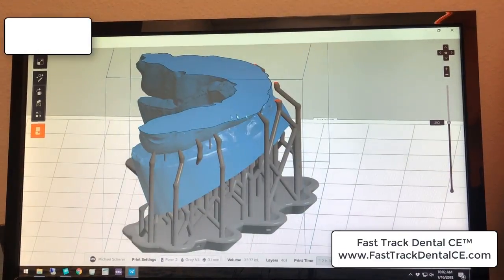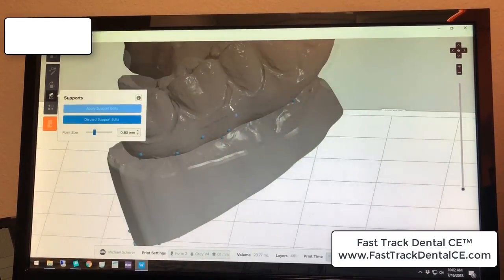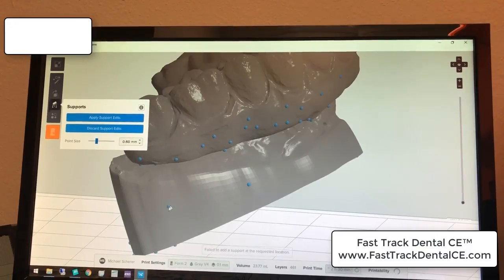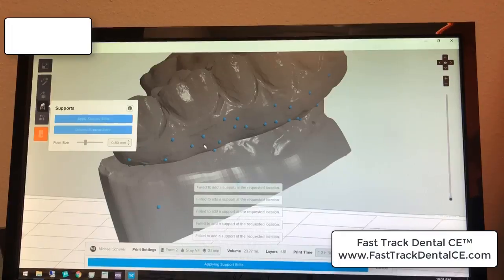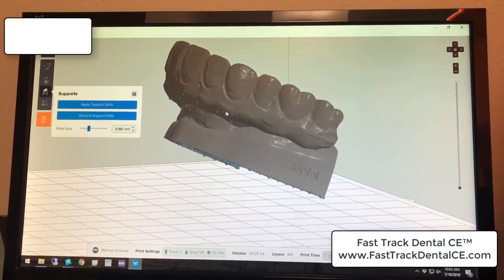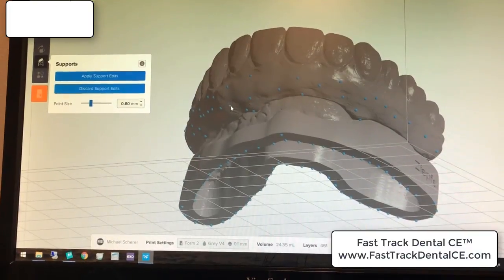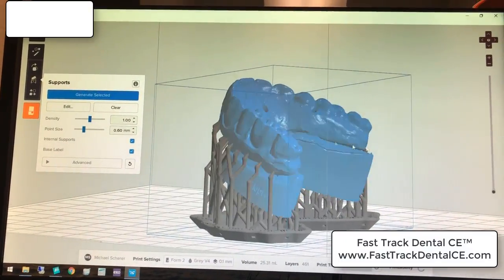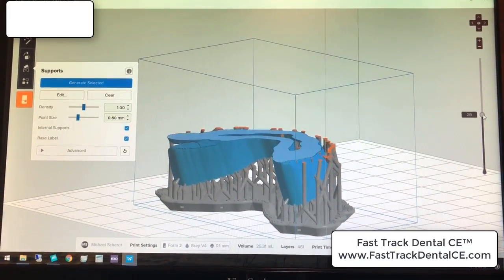There's a lot of unsupported area right in here, so I'm going to go back into my support edits and add a few extra little supports in that area to minimize the chance of failure again. And just for good measure, I'll add some on the other side too. Many of these overhanging areas are really tricky to work with and I do not like printing failures. On an opposing model like this, it's no big deal to have a few extra supports. Now I can go back through and triple-check to make sure I don't have any unsupported areas.